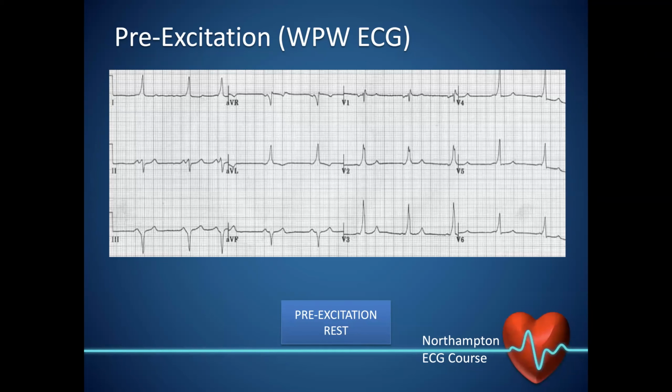Timperley. The type A and type B, is there any obvious way to distinguish it on the ECG? Because you have a lot of fellows, but to be absolutely frank, it's completely irrelevant, because as soon as you get into the EP study, you then work out exactly where it is. So it doesn't add anything clinically. It's one of those things you do to knock around in the lab before they go and have their procedure: what do you think it is, left-sided, right-sided?